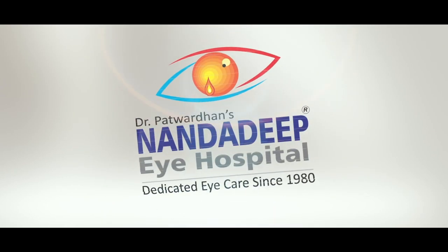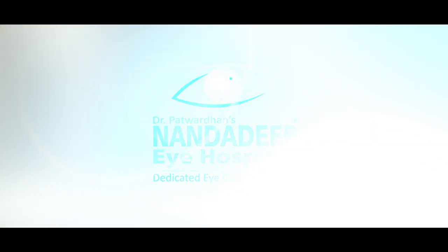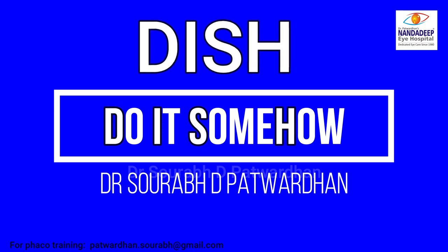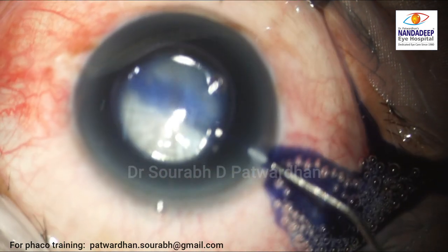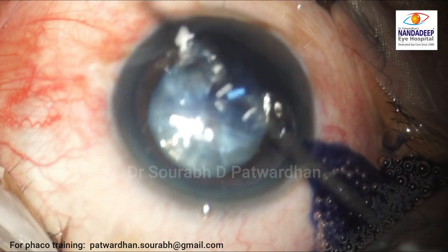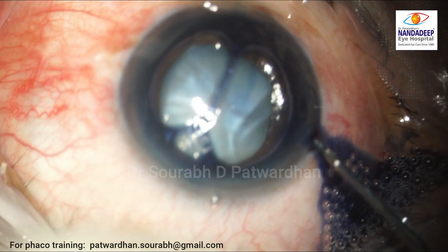Hello, this is Dr. Sourabh Patwardhan from Nandadeep Eye Hospital and Phaco Training Institute. In this video I will be talking about DISH, 'do it somehow' — many times it is taken as a technique. So let's see how this looks. This is a case of white intumescent cataract and an experienced surgeon is going to do phaco emulsification in this case.